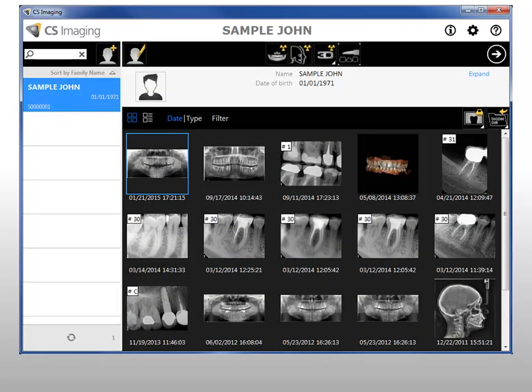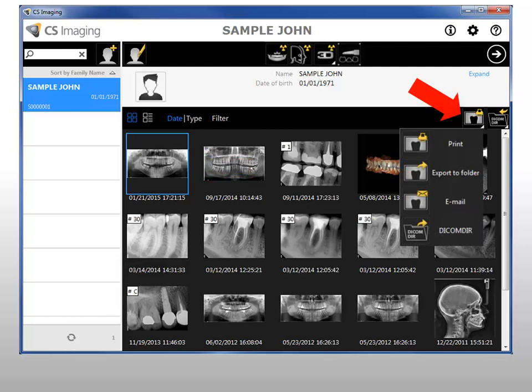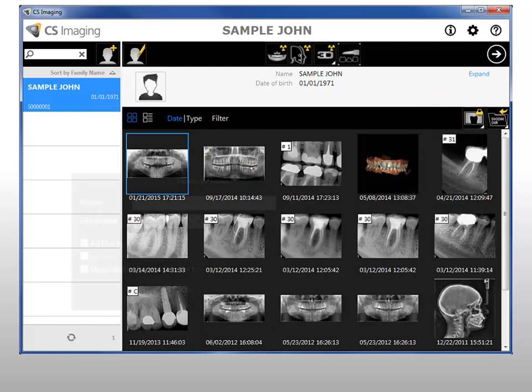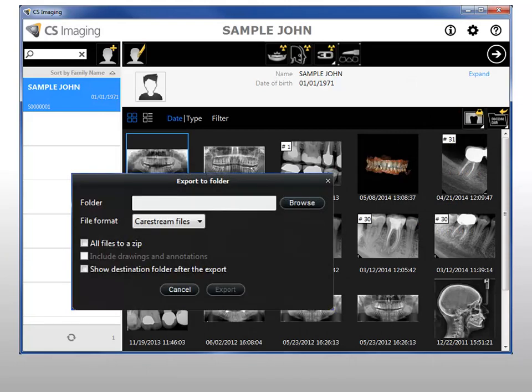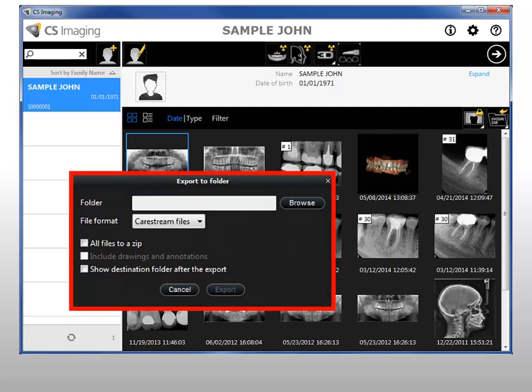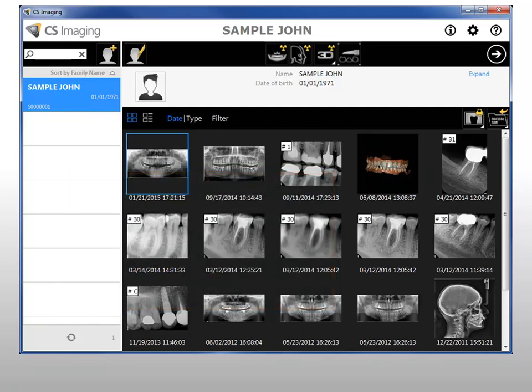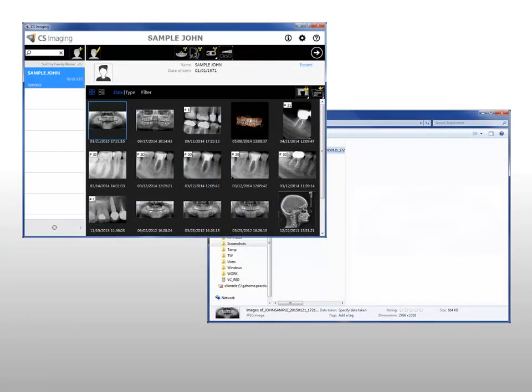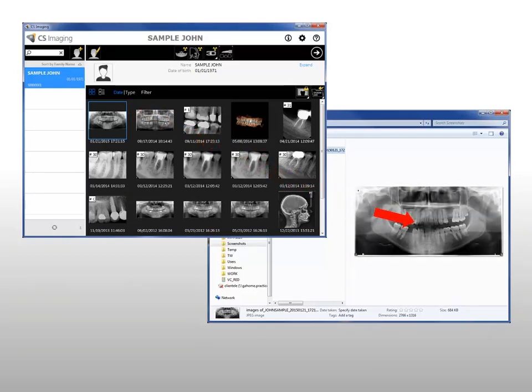To export images or files, in the Patient History, select the images and/or files you want to export. In the Image Management Tools, click Export to Folder. The Export to Folder dialog box is displayed. If this button is not visible, look for it in the Export icon group. Select your export options and click Export. The selected images and files are exported. You can also use drag and drop functionality from CS Imaging by clicking and dragging an image to a destination window and dropping the image by releasing your mouse button.